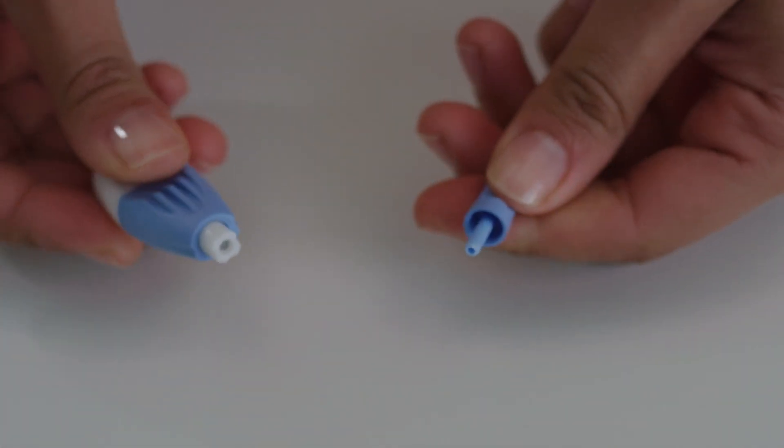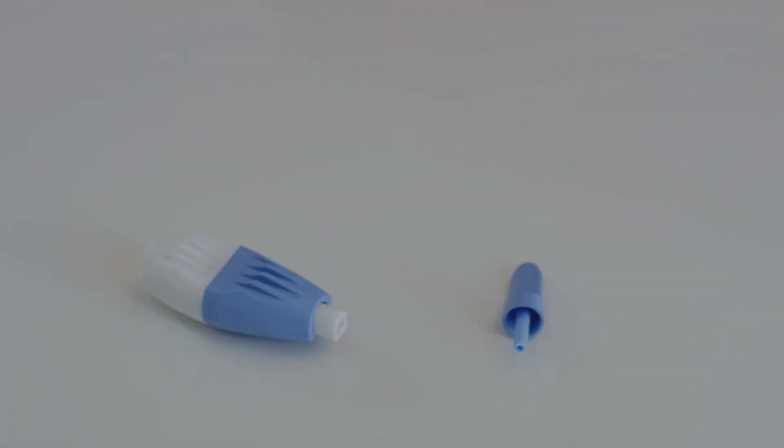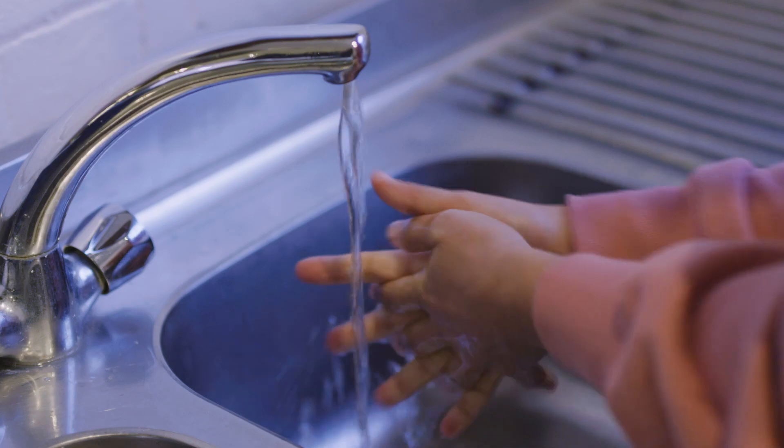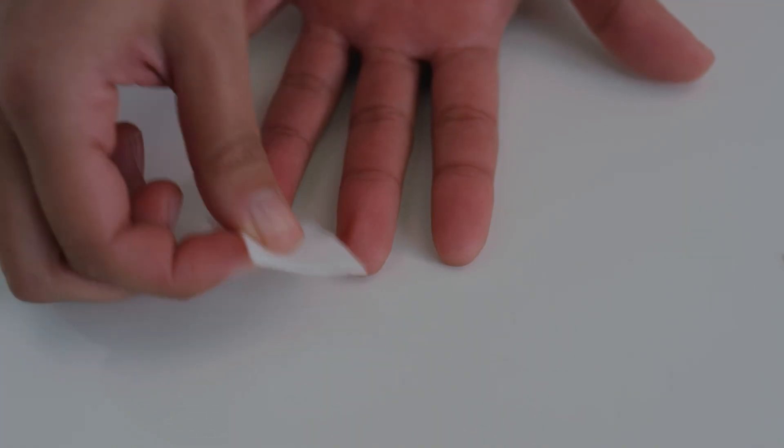Twist and pull the blue tip off the lancet. You're going to take blood from one of these two fingers on your least favoured hand. Wash and dry your hands and clean your chosen finger with an alcohol wipe.